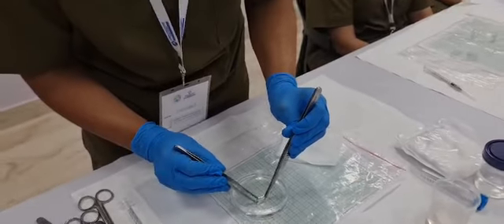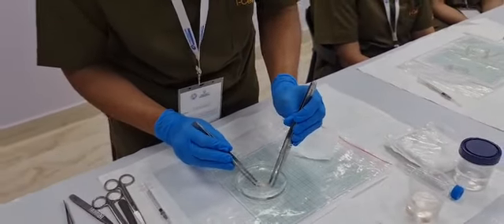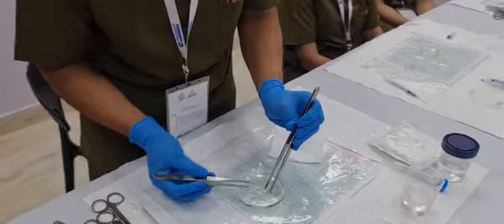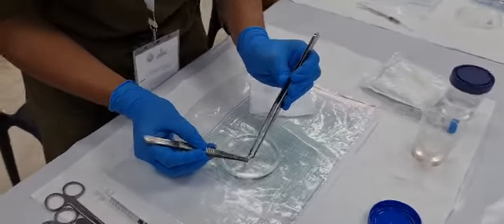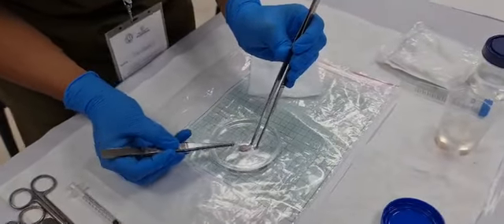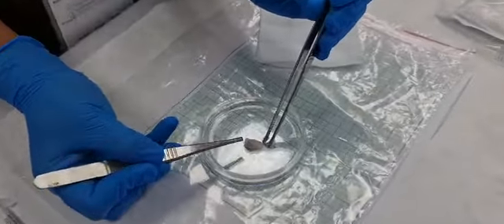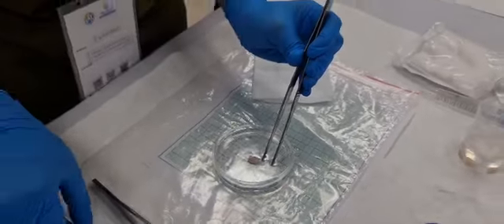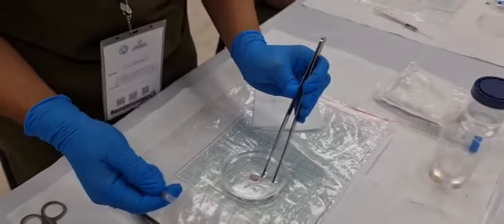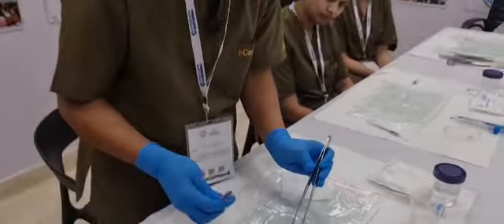In order to puncture the ovary, as we can see the follicles here — the brown portion in the ovary — you can see the follicles. To aspirate the follicles, we will need a 1 ml BD syringe.